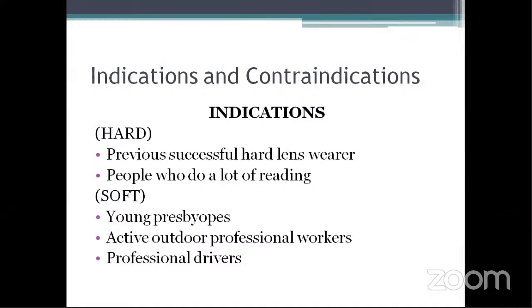It can be suggested to such patients, and since we have a wider near segment, it can be suggested to people who do a lot of near work or who do a lot of reading. Next, soft design can be suggested for presbyopes, for young presbyopes, for active outdoor professional workers, and for professional drivers.